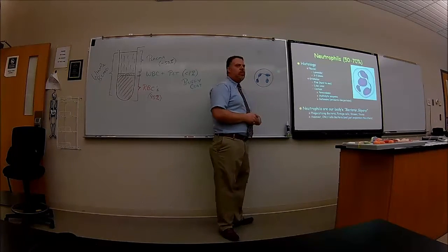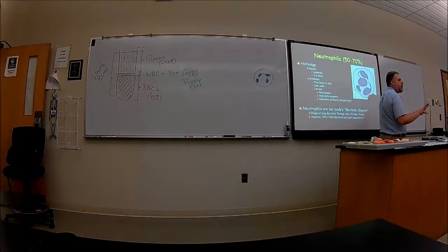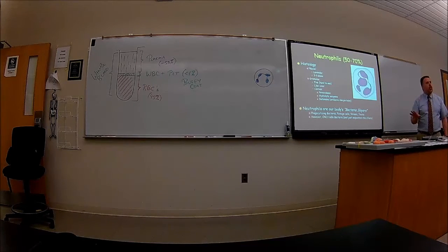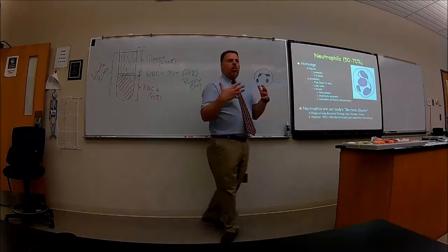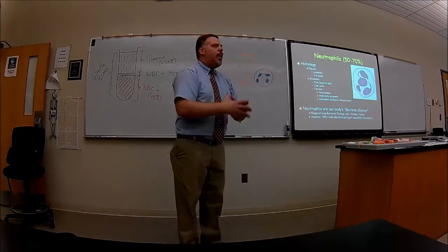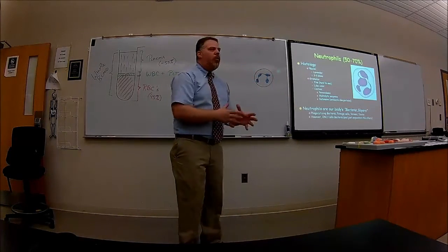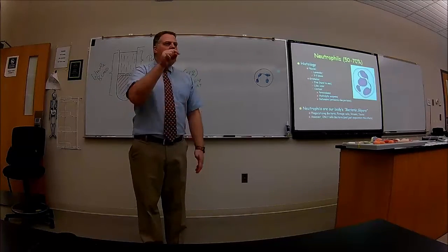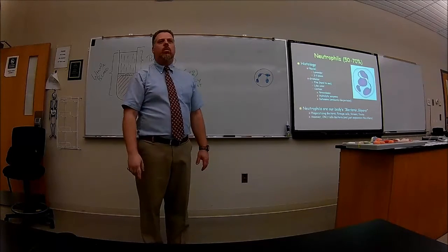And there's usually 3 to 5 lobes there. There are granules there. The granules are light complected. They're like lilac, but you'll see them. The neutrophils are there to engulf bacteria, to engulf viruses, to engulf foreign cells. But they're not there to destroy them, except for bacteria.